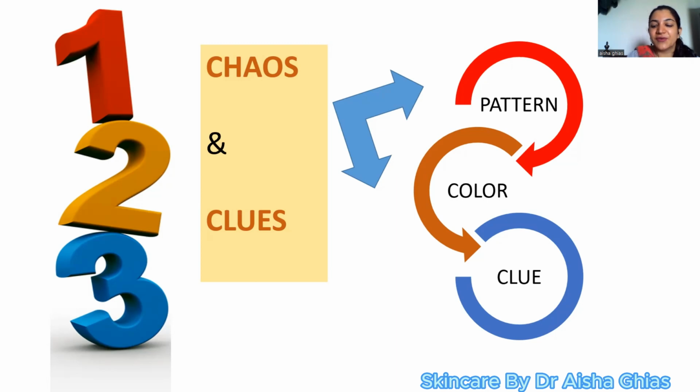So in revised pattern analysis, as we studied patterns and colors, if we consider patterns and colors at the speed of a blink, you don't really have to analyze them like we did in the revised pattern analysis. We had to analyze the images and put them in language, that it's lines, reticular, or it's globules, or it's network, or it's dots and clods.